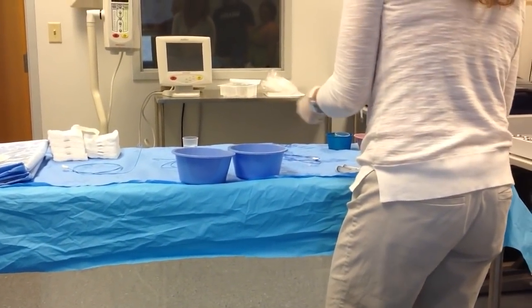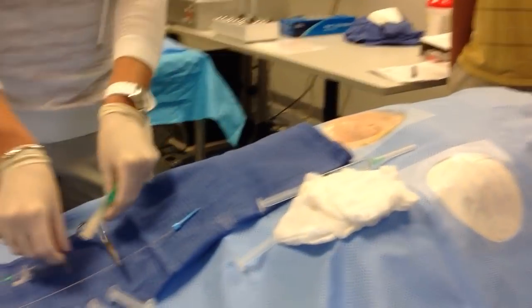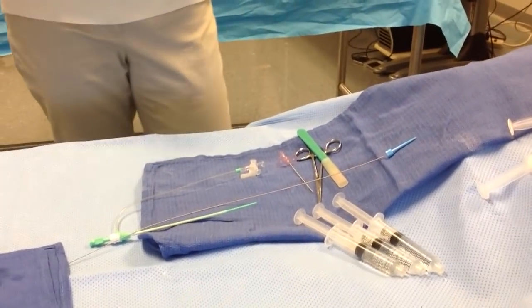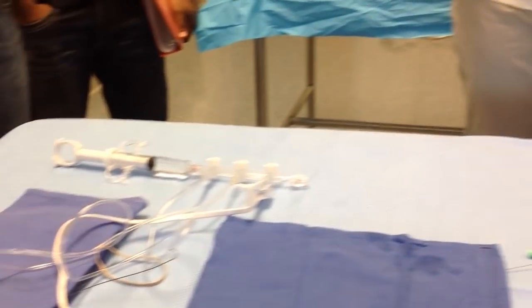Scalpels, hemostat, and needle. So this is all the equipment here. Now, your patient generally has legs. So everything's not falling down. Not always, you know. What I mean? No, not always, though, right. No, so, patient. Yeah. But then the table is pretty much longer in the cath lab, so you have more area to work with.